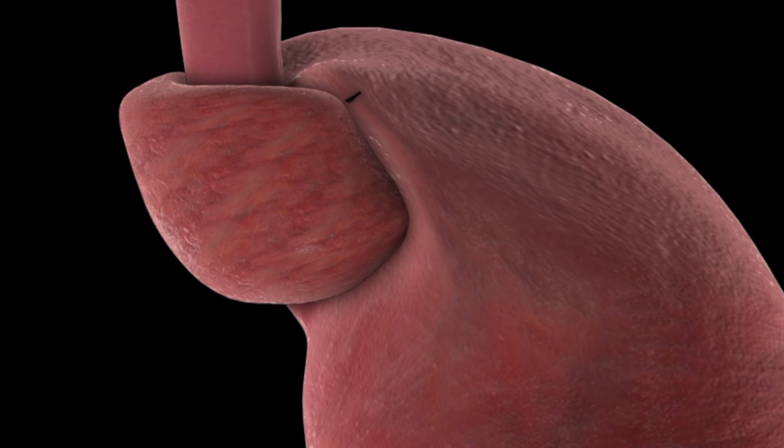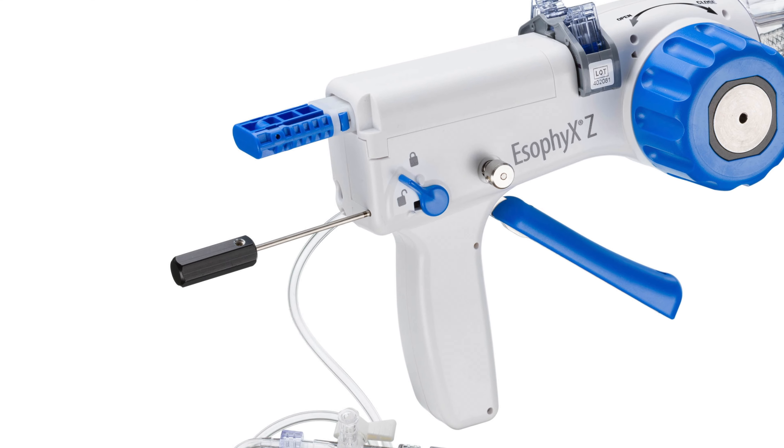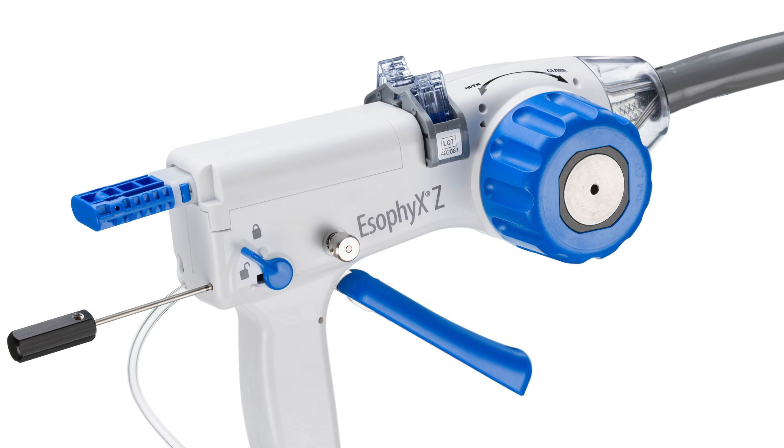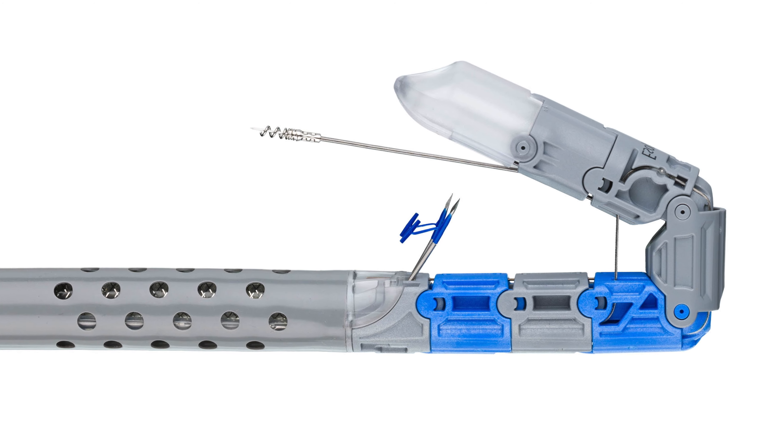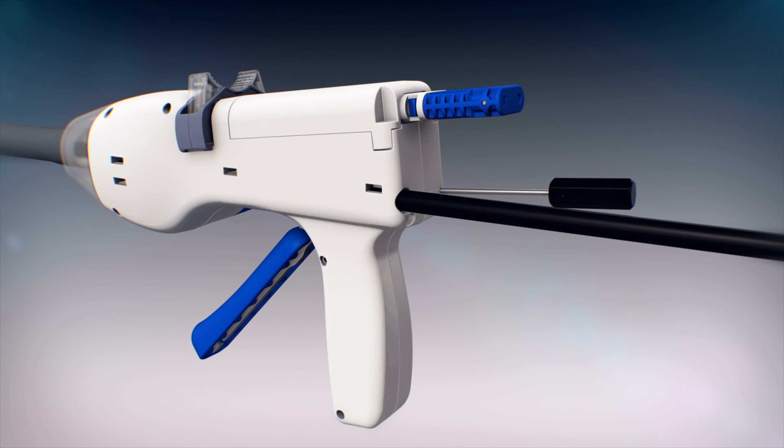Traditionally, a Nissen fundoplication, or stomach wrap, is the standard approach to surgically tighten the LES and requires small incisions over the abdomen. However, there is a procedure that can tighten the lower esophageal sphincter without any incisions, called transoral incisionless fundoplication, or TIF.